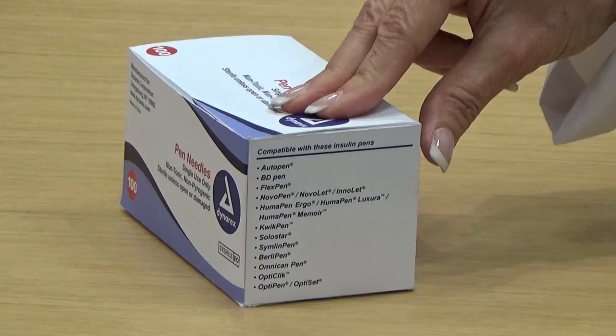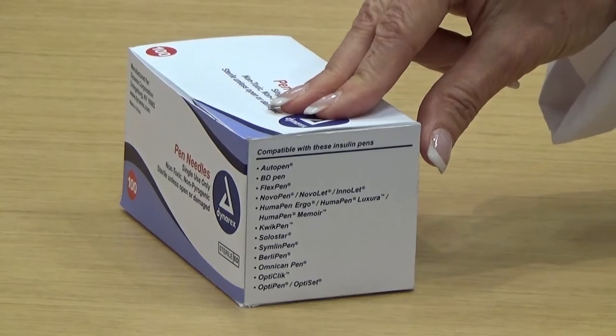I want to talk to you about our pin needles. They come in a variety of sizes and they're compatible with many insulin pens, as you can see here on the side of the box, and now I'd like to do a demo.